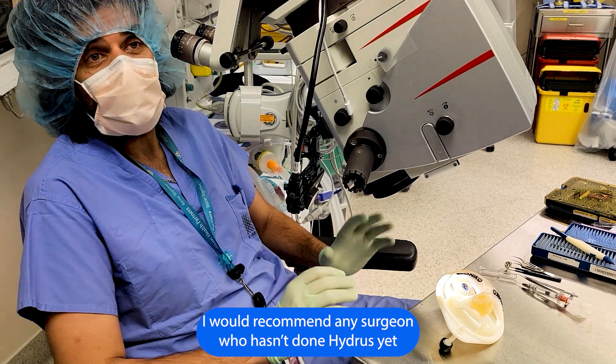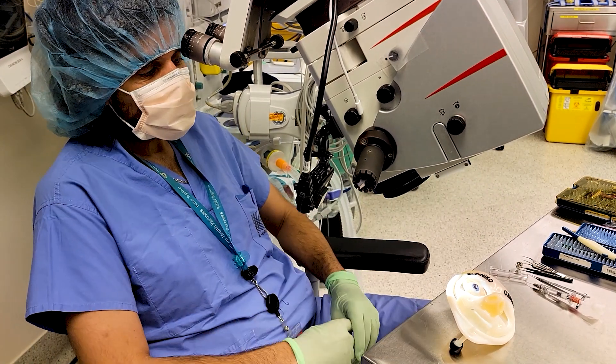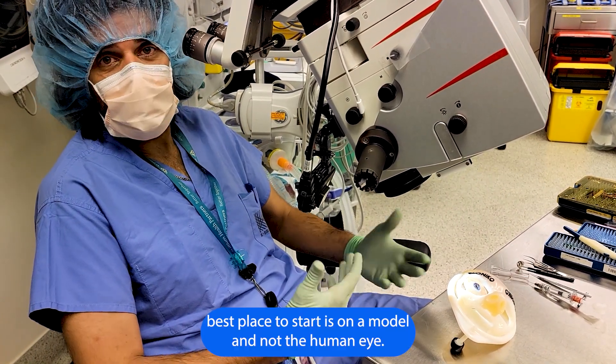I would recommend any surgeon who hasn't done Hydrus yet to start with a model eye — go through the motions, go through the hand motions, go through the simulation. best place to start is on a model and not the human eye.